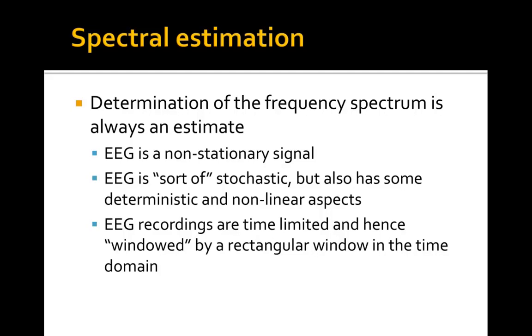The EEG is also most likely nonlinear, meaning that the differential equations that would define the state of the brain and the EEG at any one time are probably not linear models. However, as with stationarity, for nonlinearity we often make an approximation of linearity over a certain range.